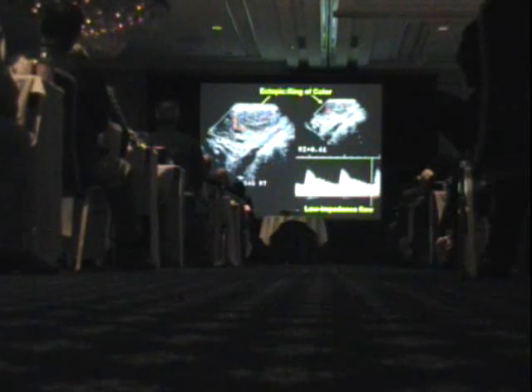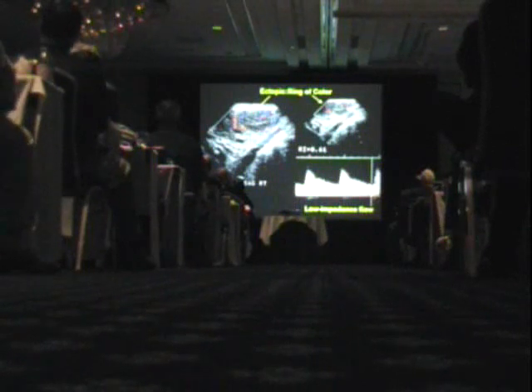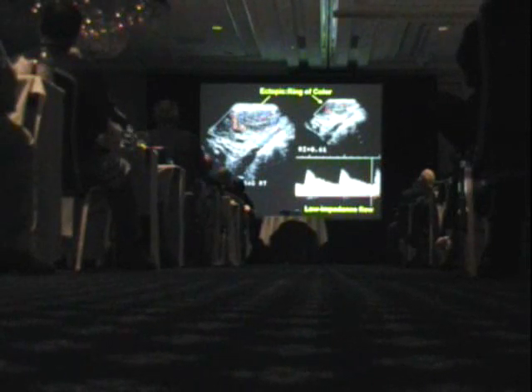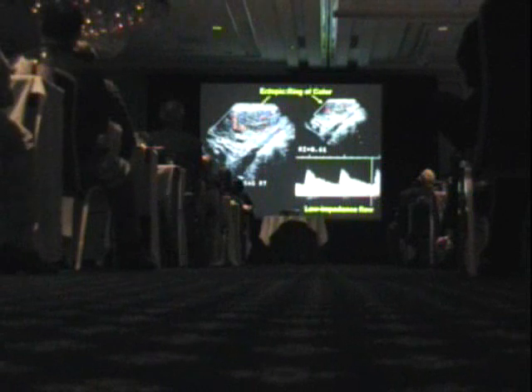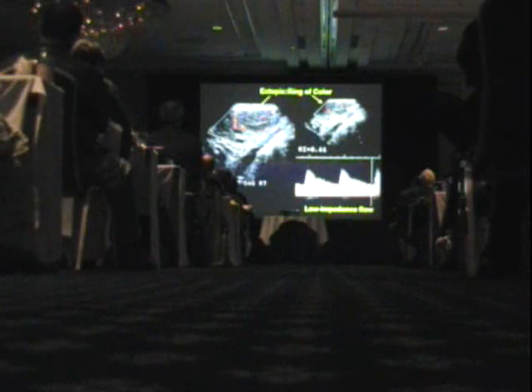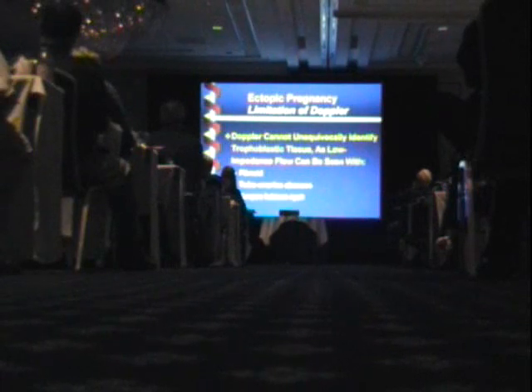Doppler I don't find to be very helpful. In general, if there's something to Doppler, then you have your answer anyway. Namely, if you see a mass to Doppler, there's a mass. And I just told you before that a mass outside the ovary in a patient who has a positive pregnancy test and symptoms indicates an over 90% chance of an ectopic pregnancy. Is your Doppler going to turn it from almost certain to certain? No, so who cares? And this is a typical example. There was the ovary, there's a mass beside the ovary. We can get a great ring of color around it and low impedance flow. But the fact that we already saw a mass before we turned on the Doppler told us we had an almost certain ectopic pregnancy. So the Doppler is a waste of time in many cases.